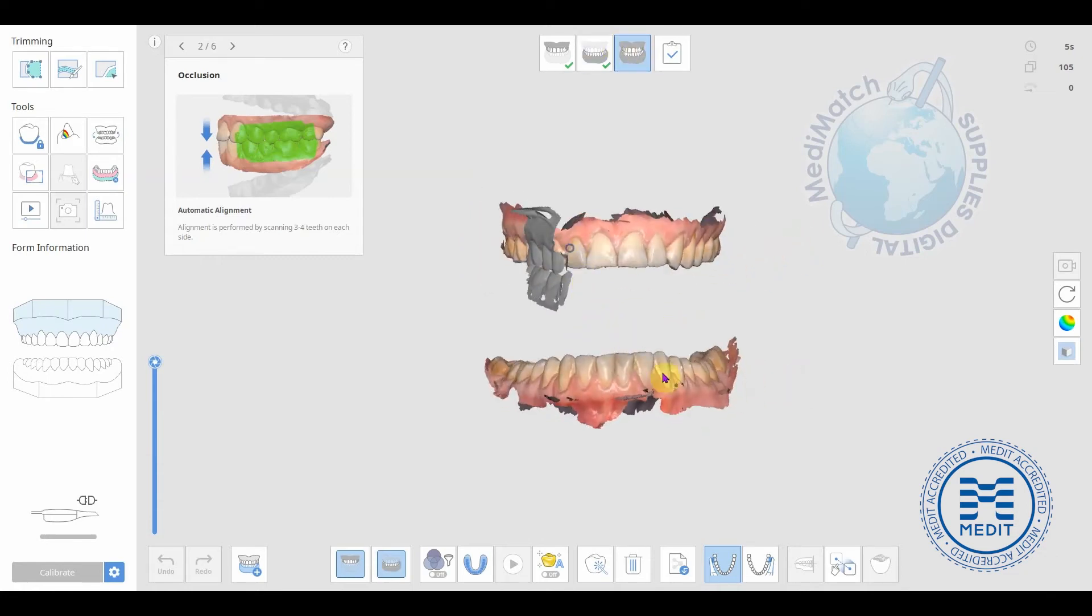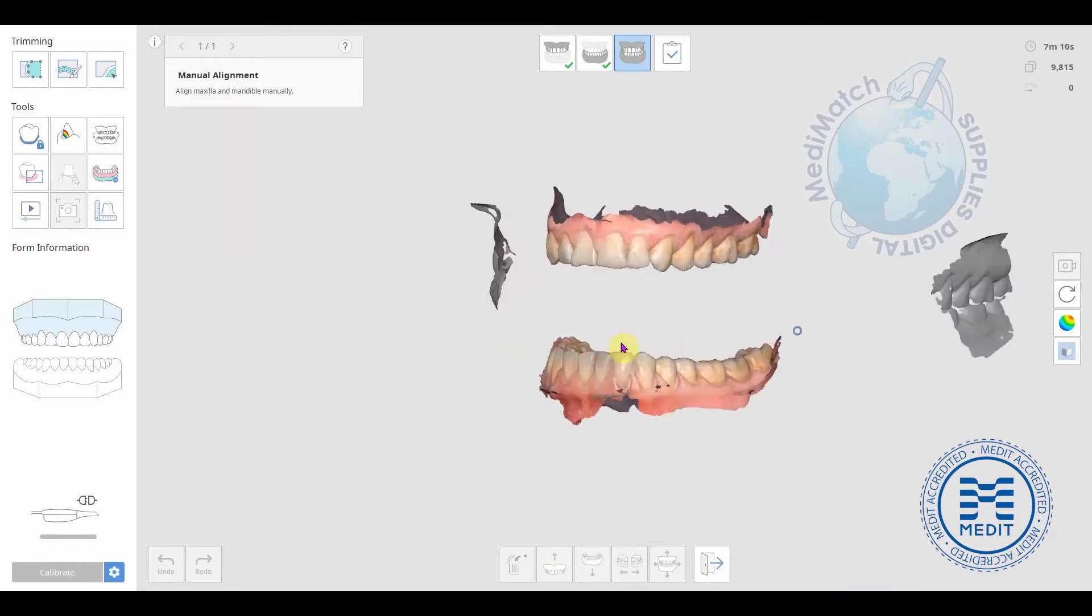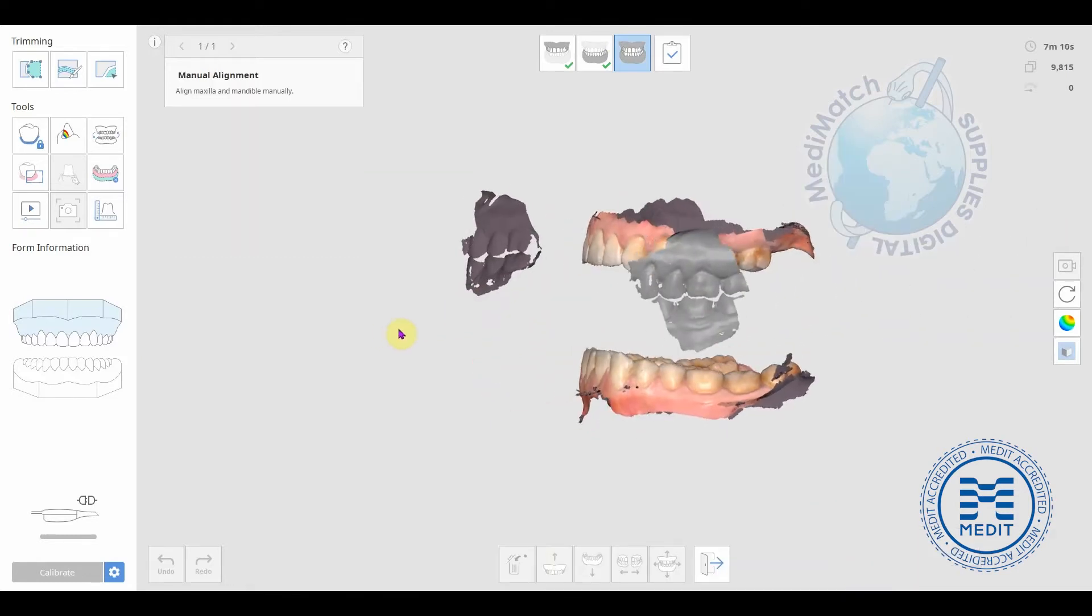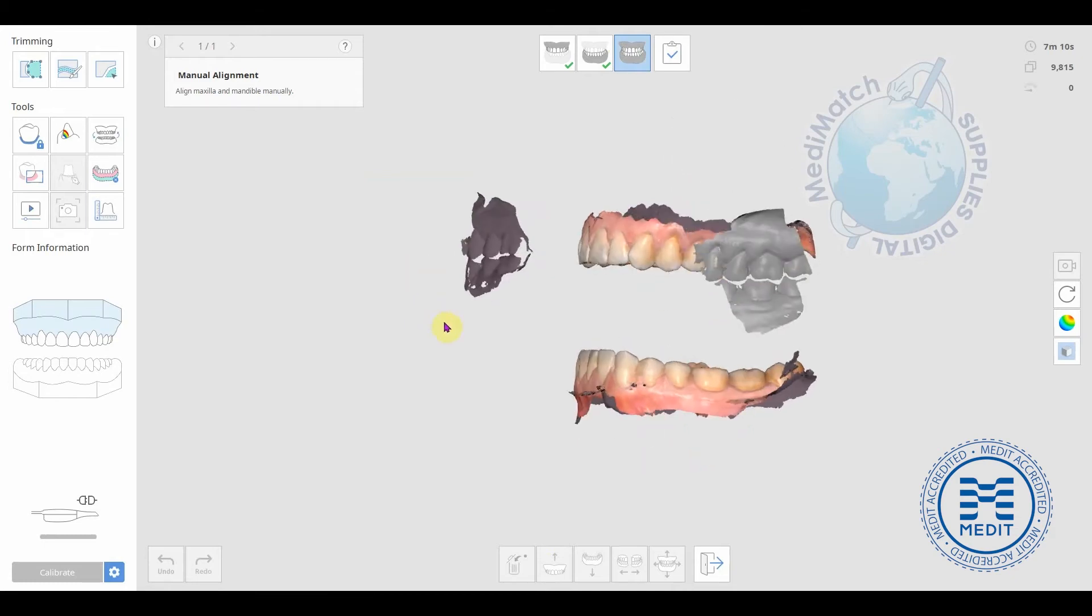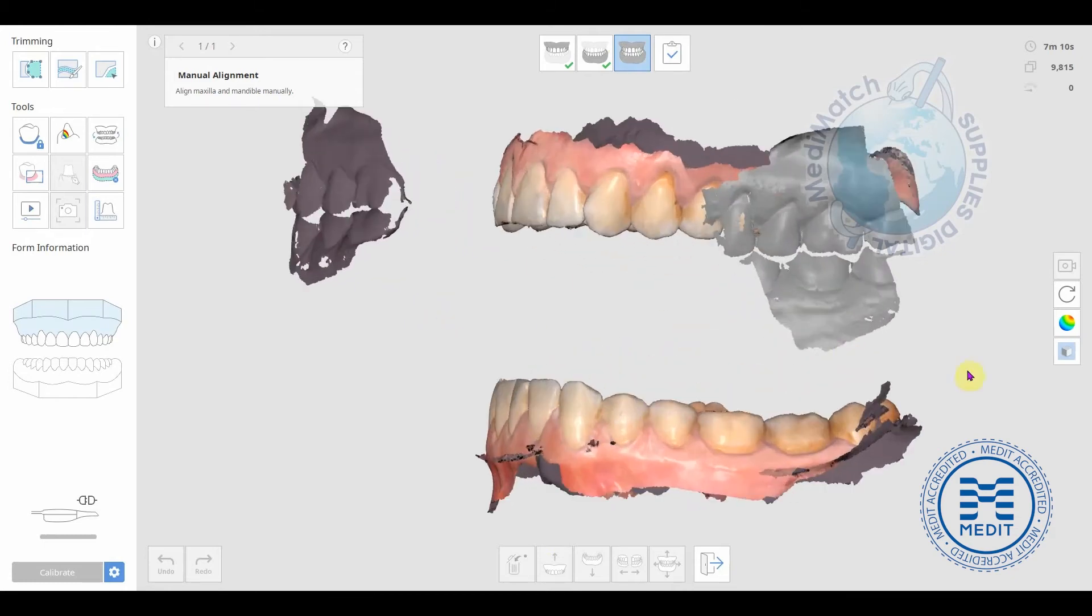All you need to do is click on this icon here, the manual alignment icon, and then you can click corresponding points on the occlusion scan and the upper and lower arches.